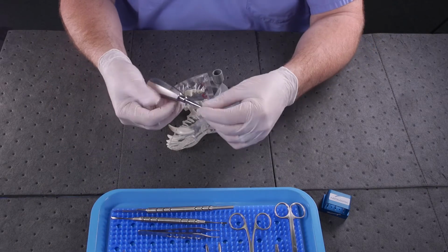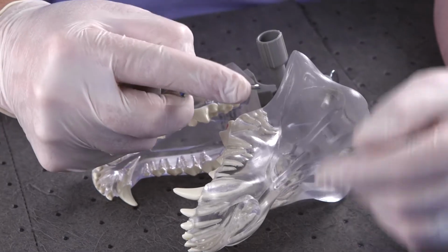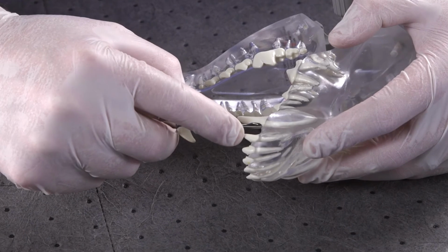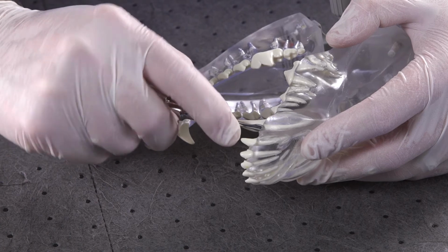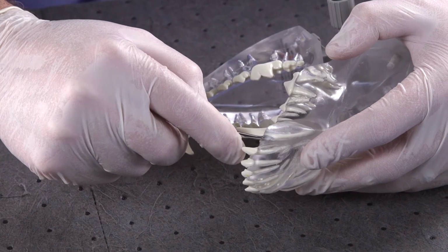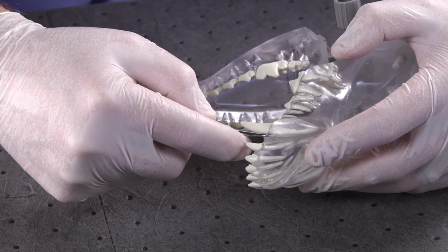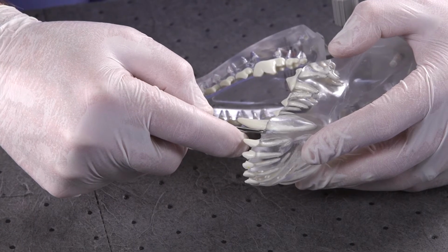The number 4 winged elevator, the bulb fits in the palm of the hand, grasped firmly, and then I use the finger to act as control over this instrument. I'm taking this instrument, going between the root and the bone, making sure I get into the periodontal ligament space. I'm pushing in as I oscillate back and forth to go deeper and deeper between the root and the bone. When I can go no further, I'm going to apply twist and hold to stretch and fatigue the periodontal ligament fibers. I need to hold this for 30, 40, and sometimes even 50 or 60 seconds.